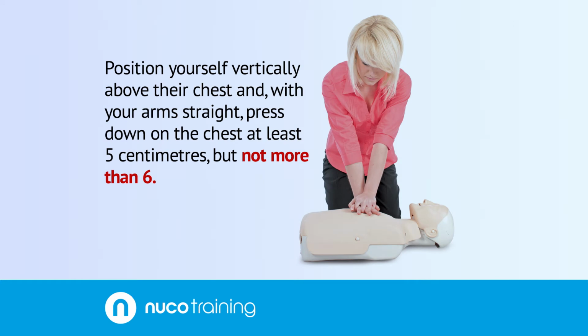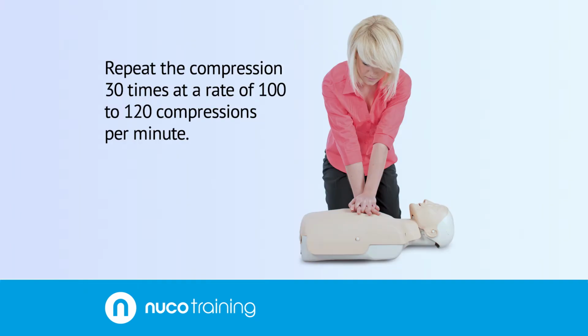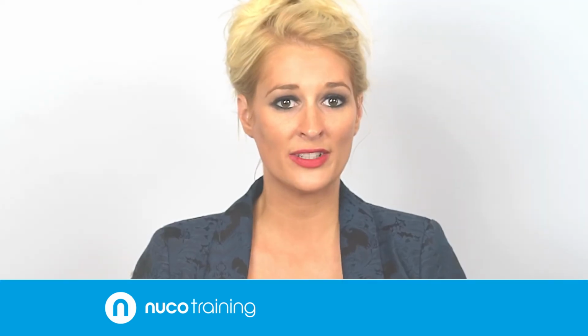Position yourself vertically above their chest and, with your arms straight, press down on the chest at least 5 centimeters, but not more than 6. After each compression, release all the pressure on the chest without losing contact between your hands and their chest. Repeat the compression 30 times at a rate of 100 to 120 compressions per minute. Compression and release should take an equal amount of time.